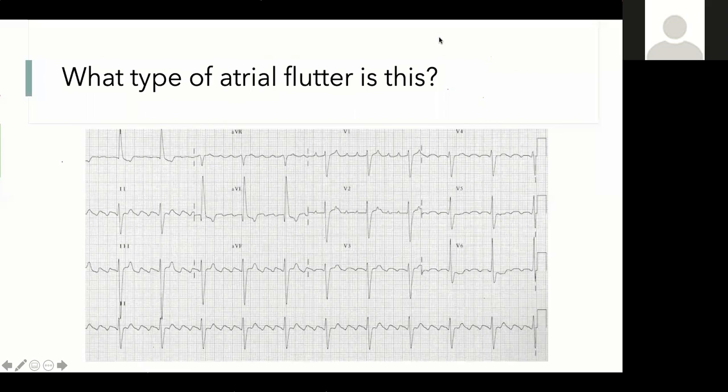I had the doubt because there it was written a 1-to-1 ratio. The 1-to-1 ratio is the most dangerous one because that means the patient is hemodynamically unstable. So 1 P wave, 1 QRS, but pathological. Okay? Thank you. Any questions?